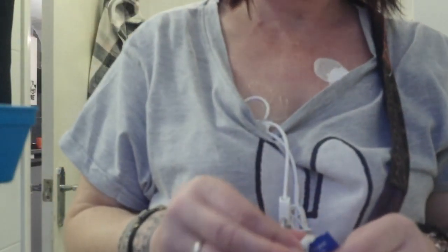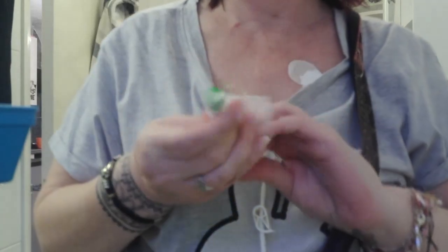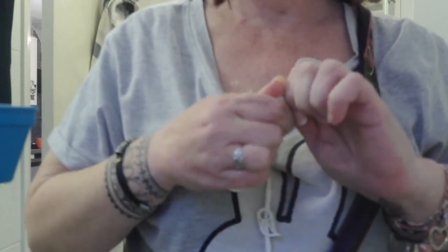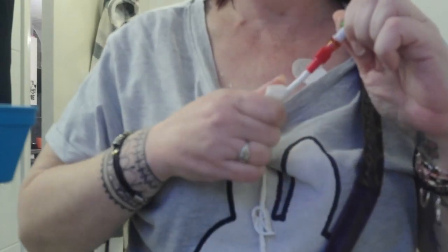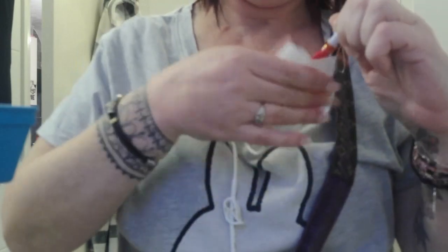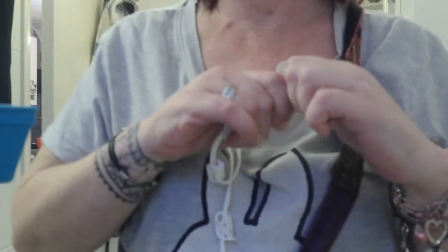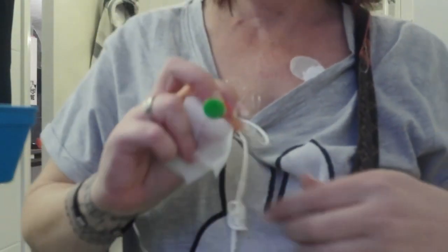Let's give this a nice little pre-clean. I like to pre-clean before I actually do the aseptic bit. Just clean all of it, because it's against my skin, and obviously you get the normal bacteria, and I don't want all that.